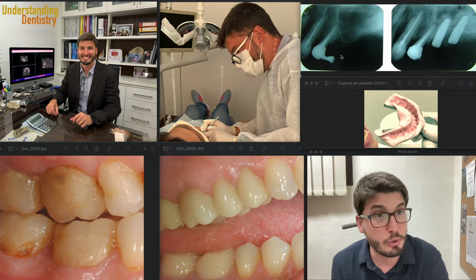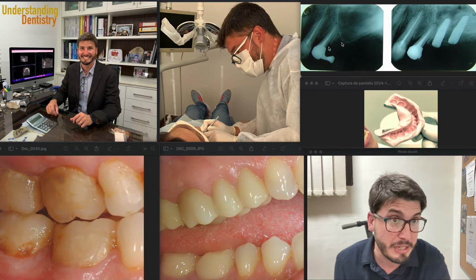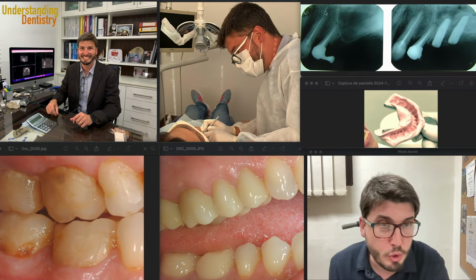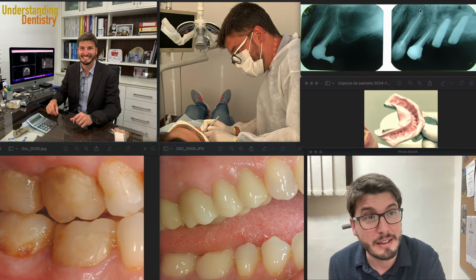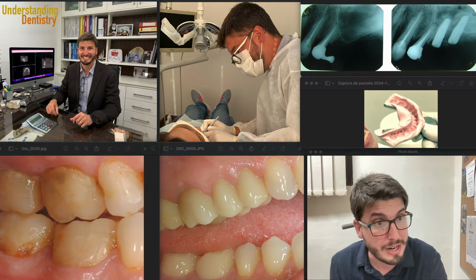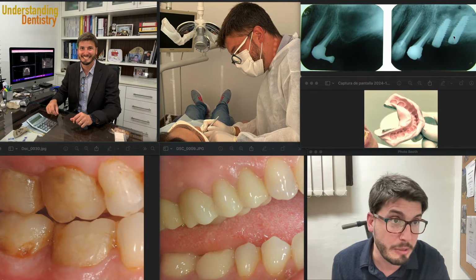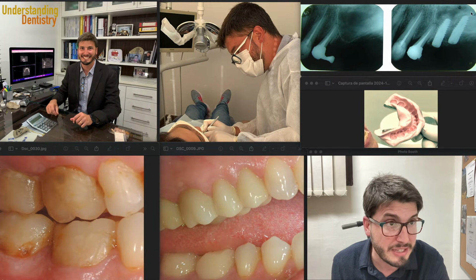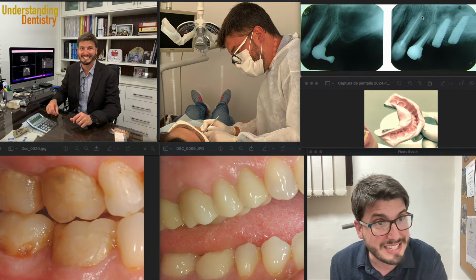So you are going to take radiographs for the situations that you need. Of course this needs to be driven by the clinical examination. And then it's good to record the initial situation of the patient, because once you have the follow-up, radiographs can be used to follow up treatments, just like those two dental implant placements with sinus grafts, and even the follow-up of these already existing root canal treatments here, of this premolar and the canine.